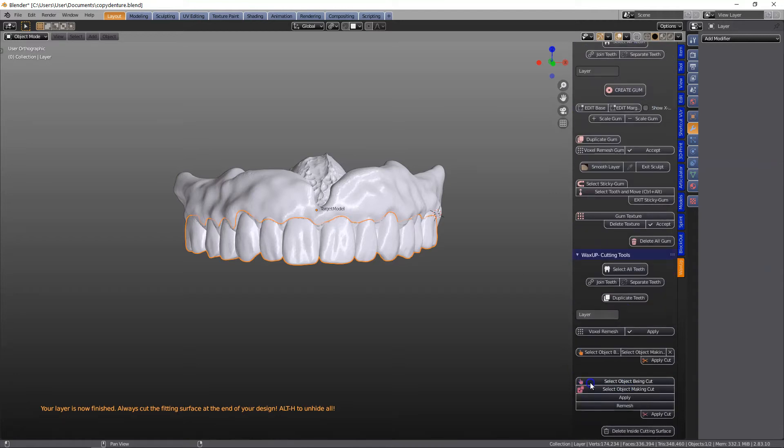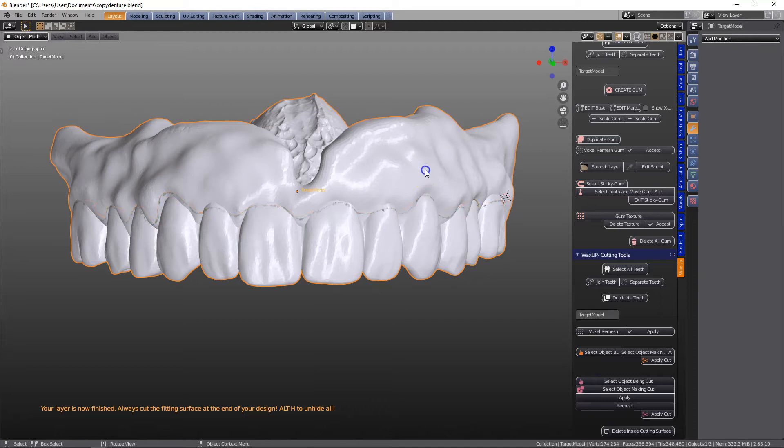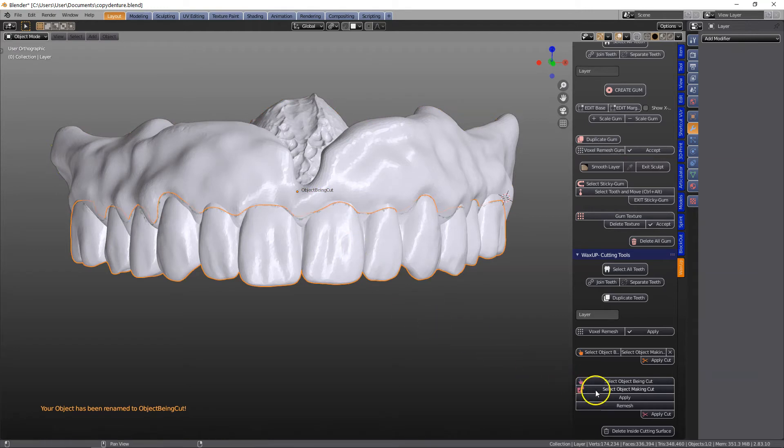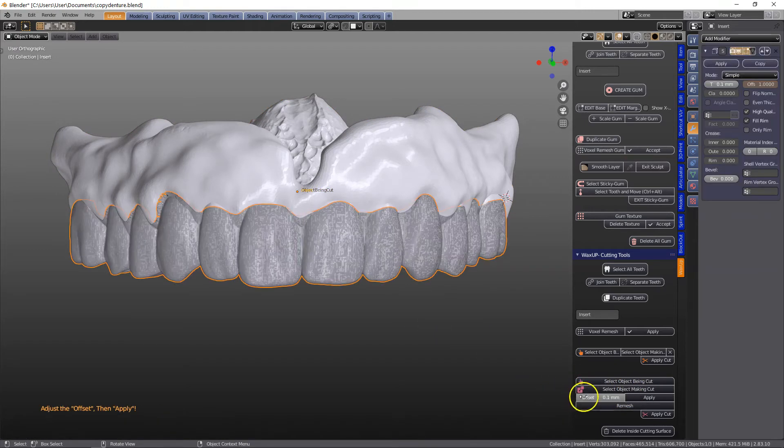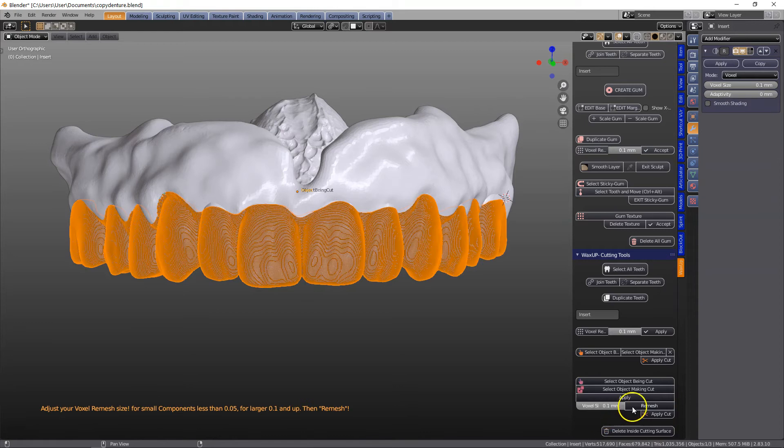Up module, select your object being cut and then select the object making the cut, and this pink menu is going to copy your object, make it bigger, remesh it, and use that specific one as a cutting tool.